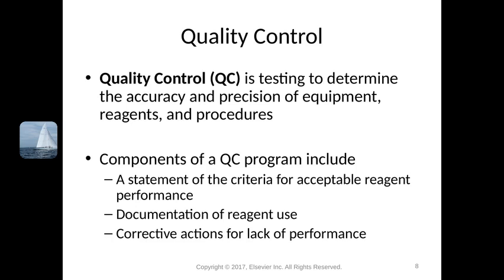You don't know where you're going to end up working. You could work in a giant lab. So they have huge automation in their blood bank, and you're super busy, and they have a huge laboratory information system, so the computer will do a lot for you. But you could also work in a small laboratory where you do everything manually. I work in two different types of laboratories right now, and in one I have automation and in one I do manual. And we do use the same computer system, so I'm a little spoiled there.